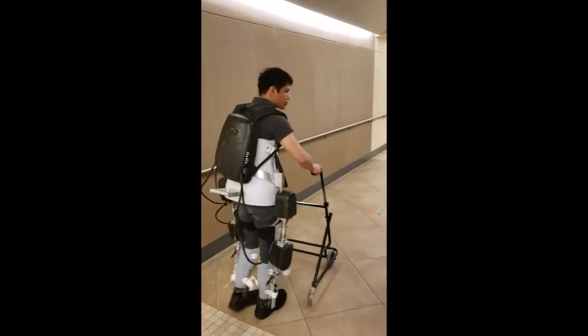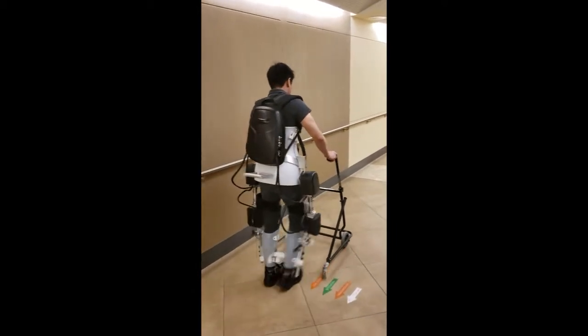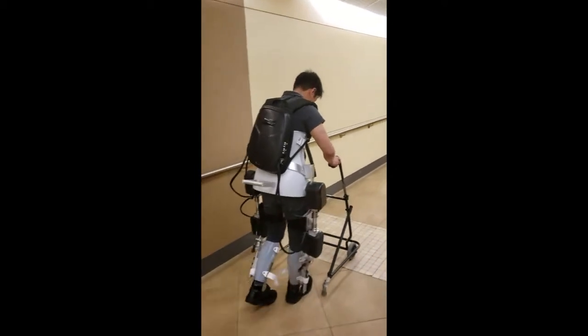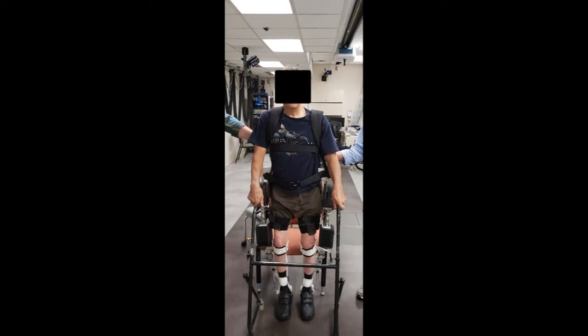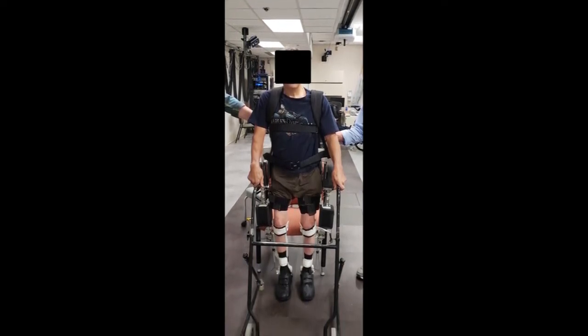Every exoskeleton pilot is different, with each pilot differing in weight and limb length. Each SCI pilot may have different muscles available to be recruited, with varying levels of atrophy. The guiding question is, can an exoskeleton learn to adapt to the SCI pilot's unique characteristics and muscular ability?